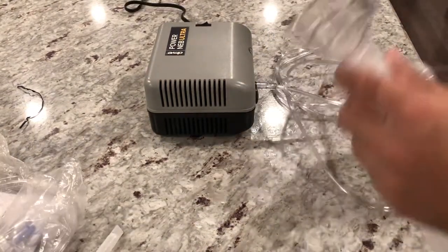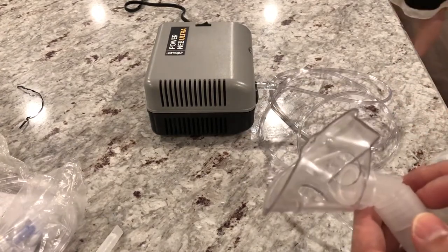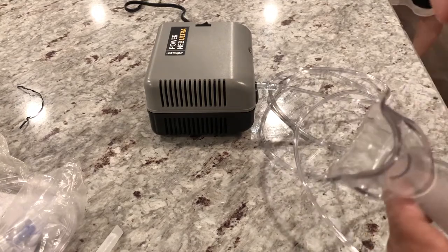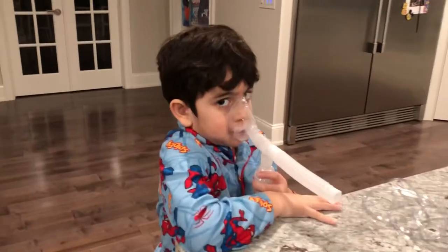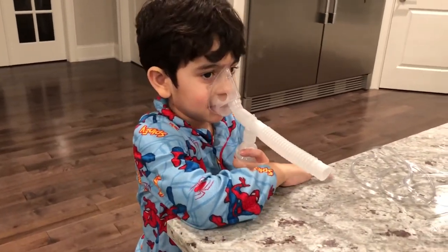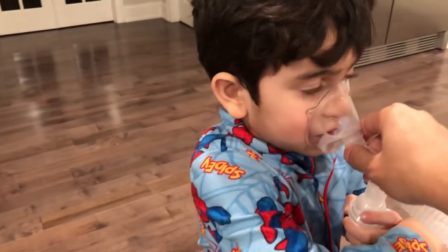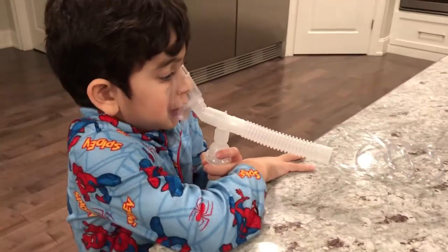I took off that blue band that was getting in the way. Let's try it out. Alright, how do you like it? Good, yeah. Is it working? Make sure you breathe it in. Hold it there — yeah, that's it. It works pretty good.